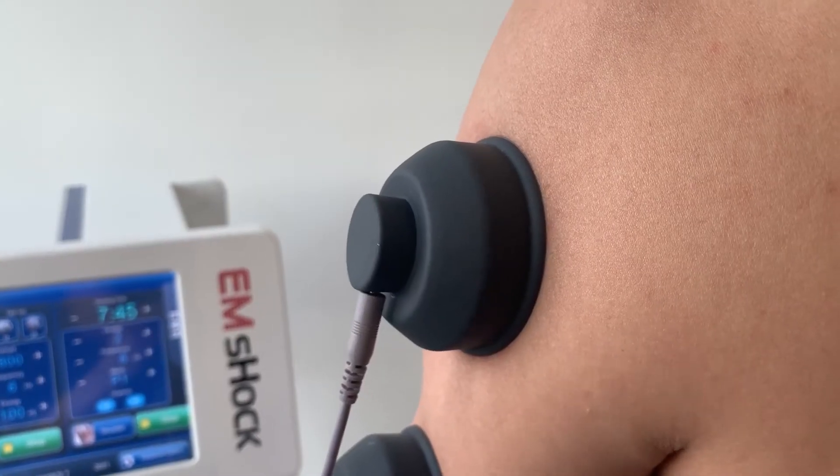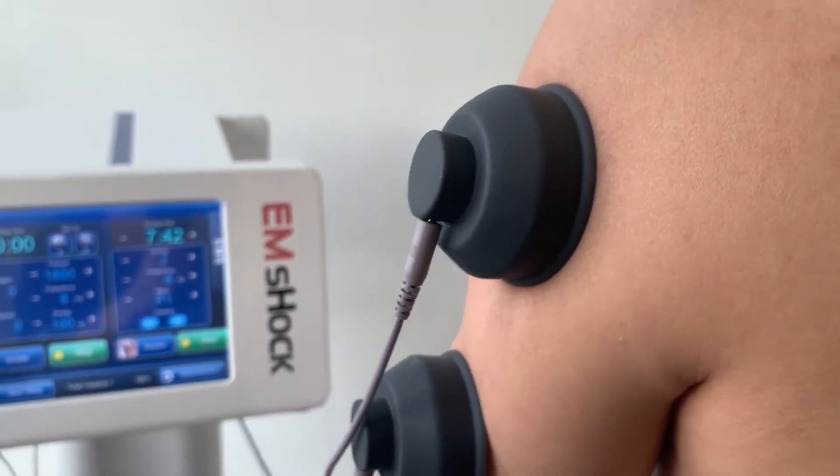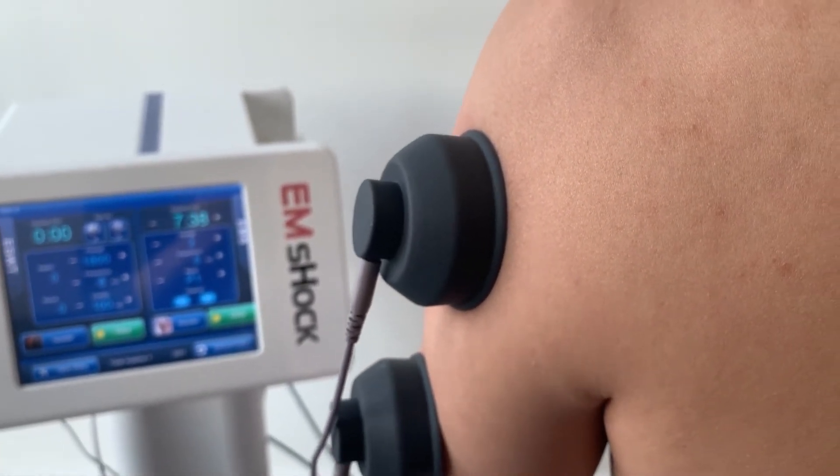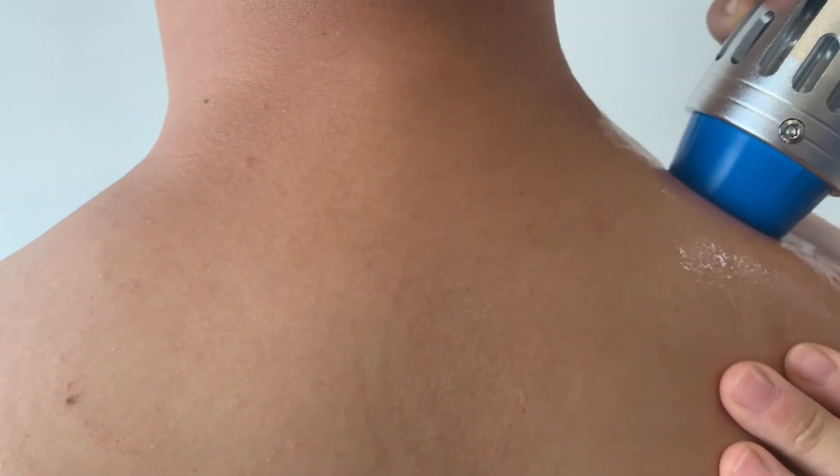While the EMS is working, we can use the shock wave at the same time to treat other body parts. Choose shoulder, set seven parameters, and let's start.